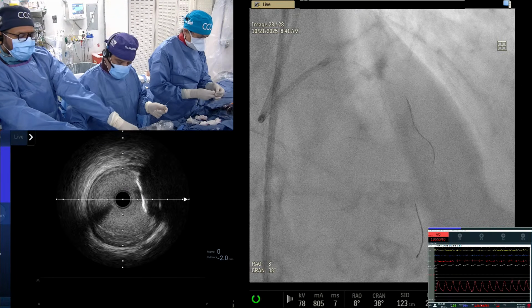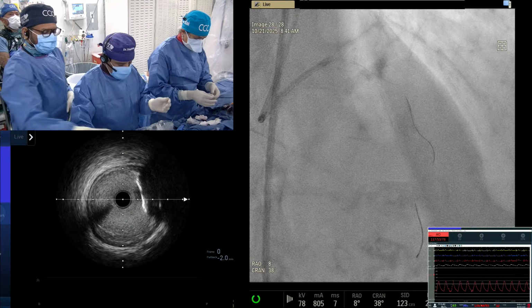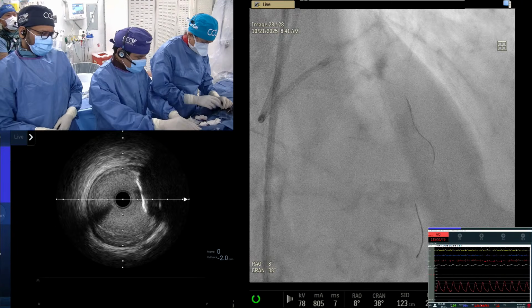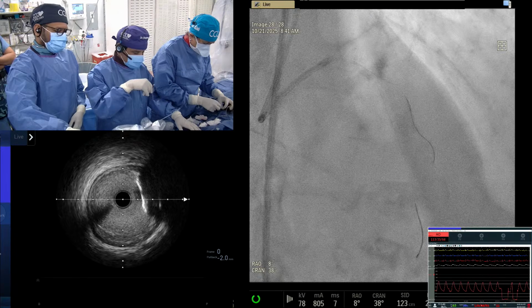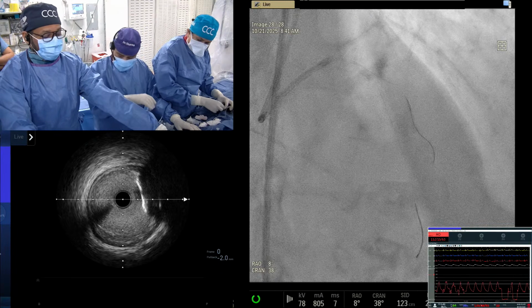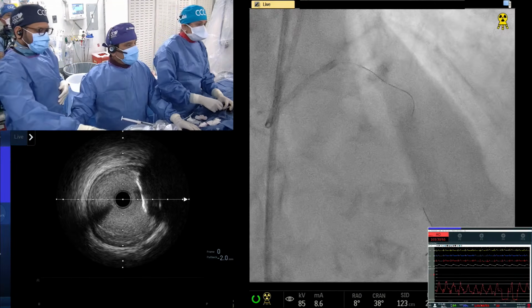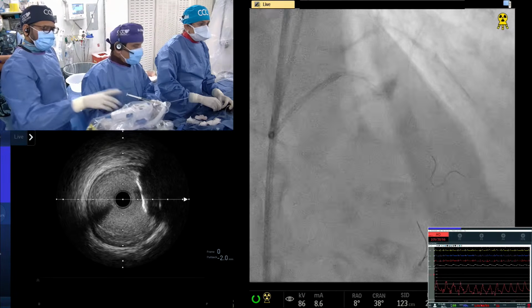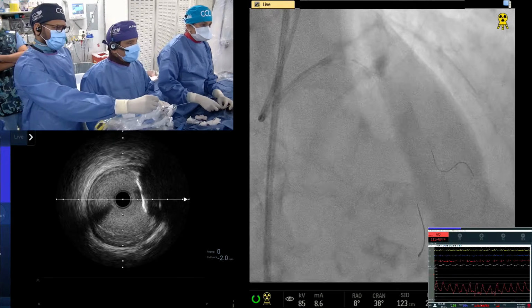So the question was, why did the IVUS go pre-rota and not go now? We have probably created a small shelf of calcium. Remember that it was almost 300 degree calcium, not 360. We disrupted that, and you see that disruption after the cutting. After the bifurcation there is definitely a disruption. We'll show that in 1 minute. But now we are doing the IVUS of the diagonal.